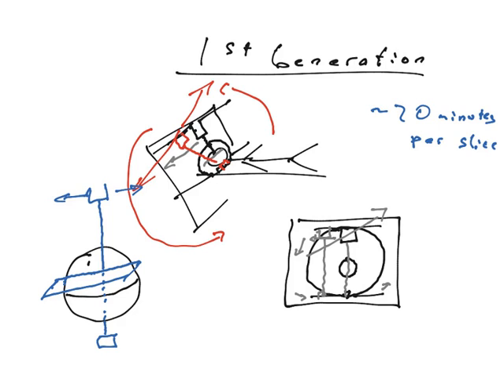Until you've gone from the tip top all the way to the bottom of this object, creating slice after slice after slice, and then you put all the slices together to recreate the three-dimensional object you started with. Well, if each slice takes 20 minutes, this is a very long process. So they had to come up with a way of upgrading the machine to make this faster.